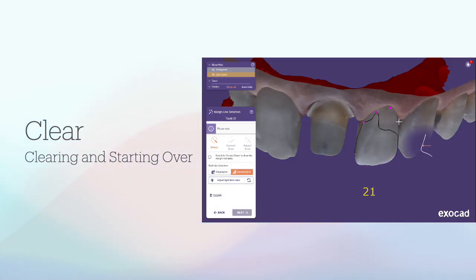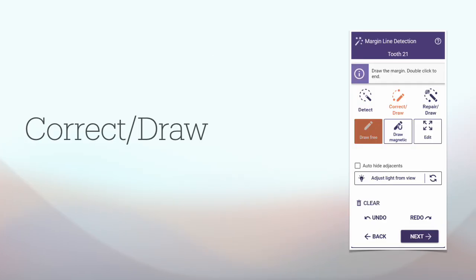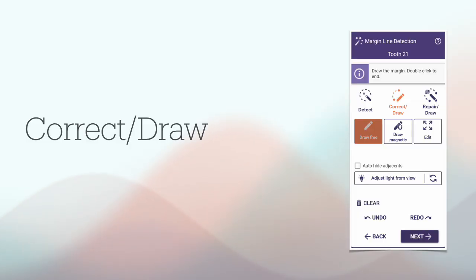If you have clicked the wrong tools or clicked outside the margin, click Clear to clear all defined points and start again. You can edit or manually draw the margin line by clicking the correct draw button in the margin line detection dialog. These are the control points that help you edit the margin.